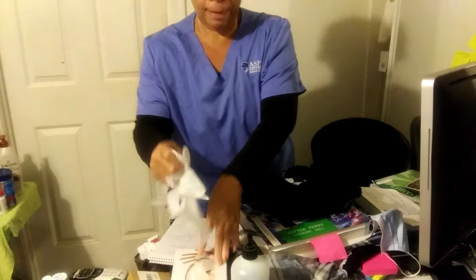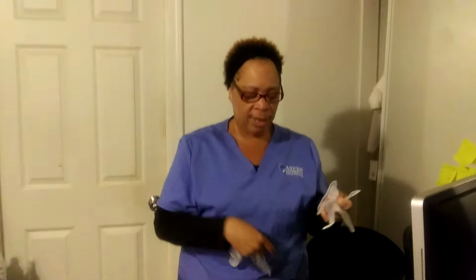Okay, I've washed my hands. Now put on some gloves. And just for demonstration's sake, I'll put my gloves on. And I'll be removing the pretend dressing I already have here.